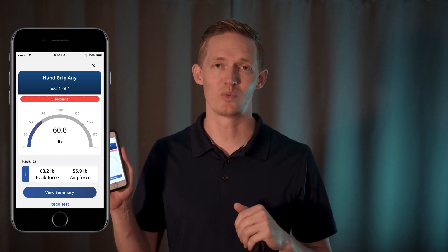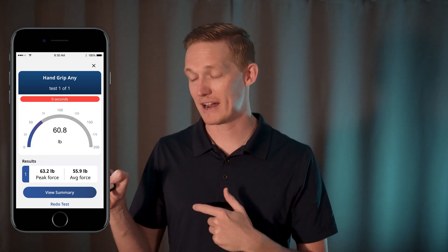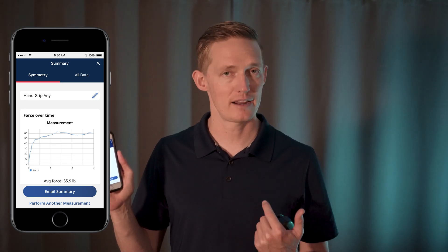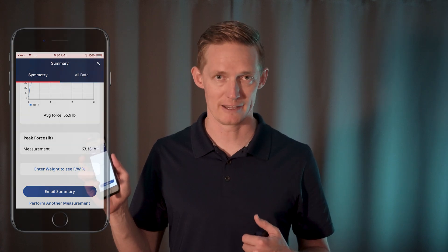You can also adjust the number of tests you wish. Here I can redo the test or view summary. On the view summary screen, I can view all my data, rename my test, enter a force to weight ratio, as well as email the information to myself.